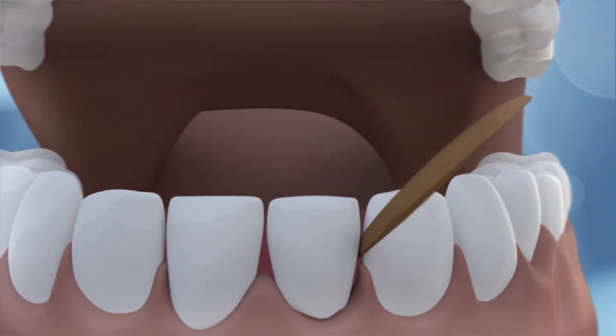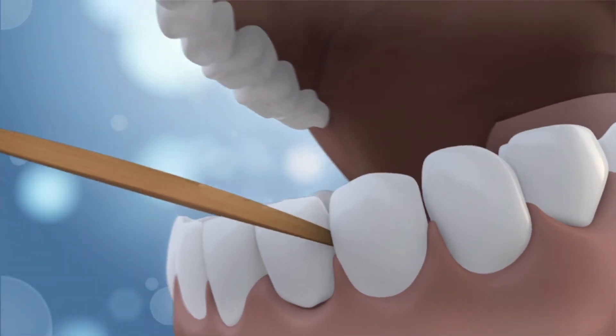Every thousand years a new idea emerges from the mind of man. Dr. Tung's flattened periostics are designed to remove plaque by perfectly fitting between teeth, and are thin enough for tight spaces.